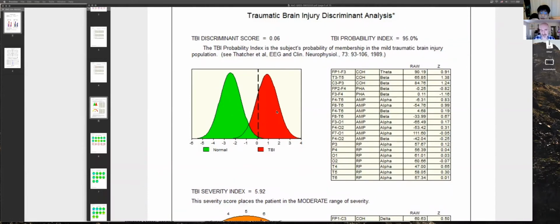Yes, but you didn't hear what I said. This does not measure injuries. I'm not looking at an injury. I'm using a concussion population as a pure case of one symptom, brain fog. It's all we're measuring. And every single time, apnea creates the signature. It's apnea making you look like this, not an injury. Every single time when people have apnea, they look brain foggy. But you can get pushed up into this population with apnea, mold, Lyme, chemotherapy, chronic anxiety, some mild wear and tear, or just having a weird brain.